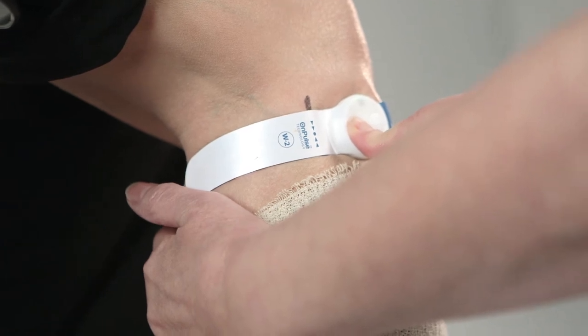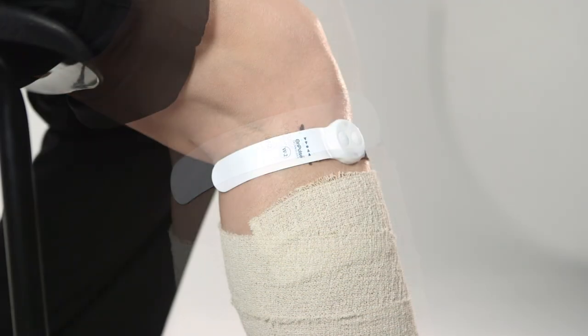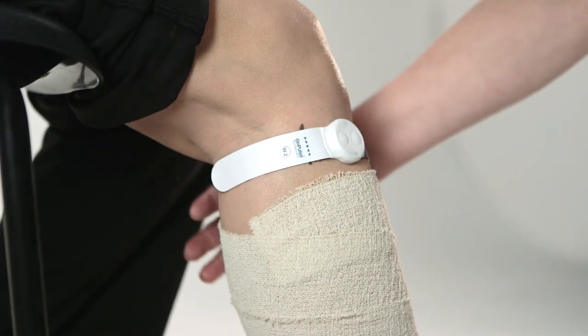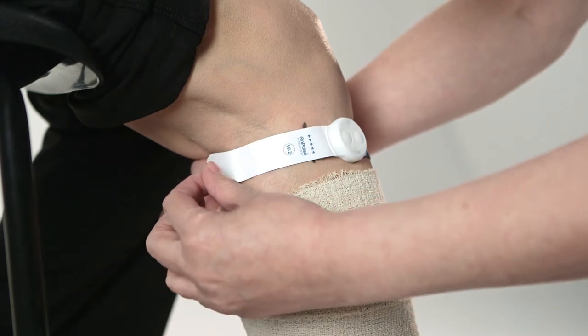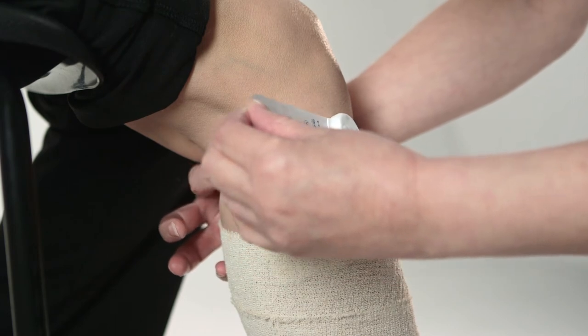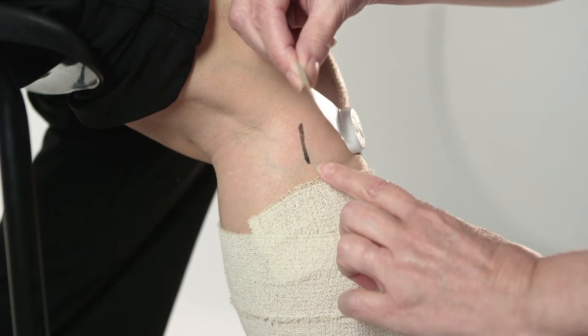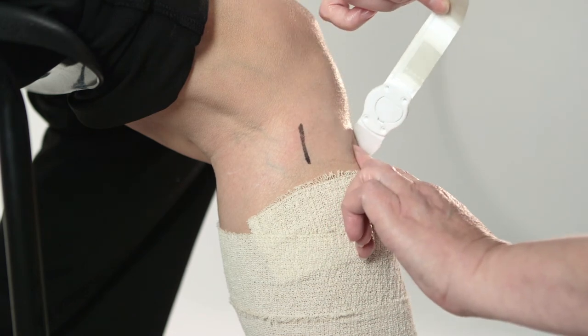Note that when the button is pressed, the LED will flash rapidly and then stop to confirm deactivation. To remove the device, slowly lift the long end of the device. Use one finger of the other hand to gently push the skin down, taking care to peel the adhesive gel off the skin along with the device. Lift the device progressively at a 30 degree angle from the leg — this will preserve the device and prevent damage to the skin.